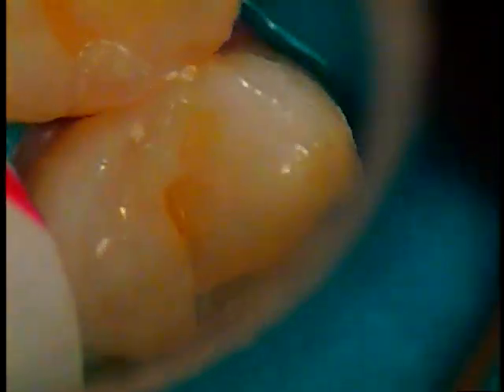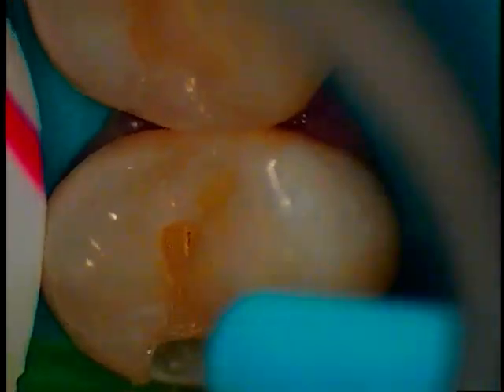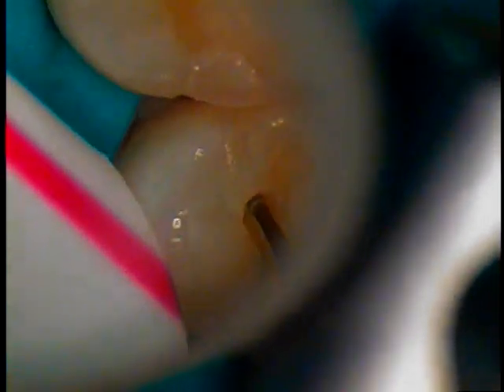Before I isolate with my band, and I will isolate first with my band before I do anything, I'd like to place the Vitrebond. And I'm going to do that as just a speck. I need to use a 1/2 quarter round burr, and I'm going to get rid of that little stain. It's bothering me. You okay underneath? Yep. Okay. That was bothering me a little bit.